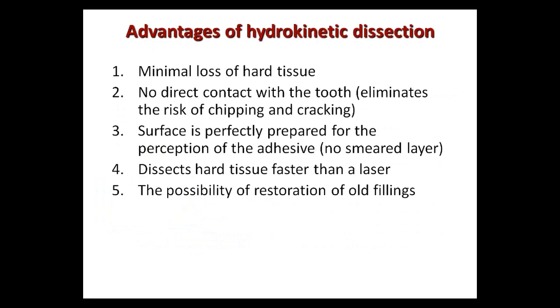Advantages of hydrokinetic dissection: minimal loss of hard tissue, no direct contact with the tooth, which eliminates the risk of chipping and cracking of enamel. Surface is perfectly prepared for the perception of the adhesive system, no smear layer. It dissects hard tissue faster than a laser, for example, or other types of preparation.